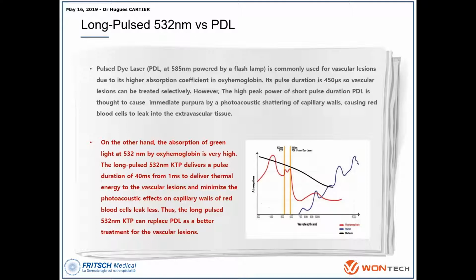We can discuss the possibility of comparing the green light, the 532 nanometers from V-laser, with PDL. It's a long story. Sometimes we can also discuss the IPL to compare; we know that both work. That's very simple to understand.